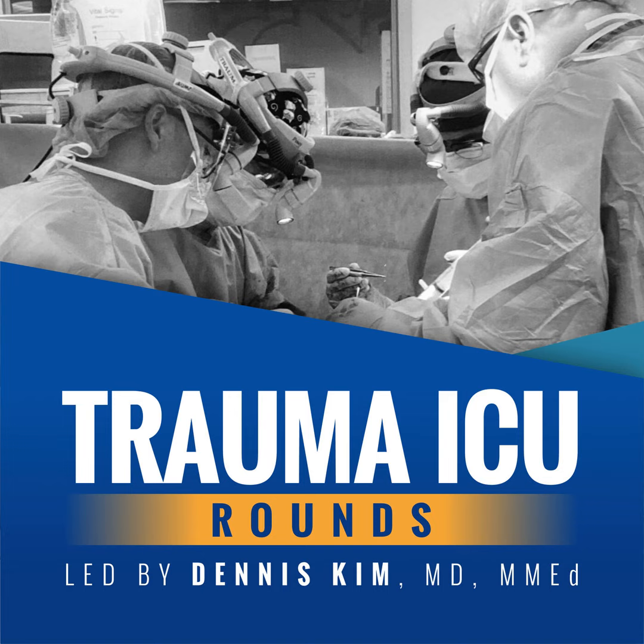So in summary, we've discussed the modes of mechanical ventilation, or at least some of the more common modes of ventilation and how we define them. And again, a mode is defined by the 3 T's. The type of breath, mandatory, spontaneous, or assisted, the targeted control, volume or pressure, and the timing of breath delivery, continuous, intermittent, or spontaneous based on the patient's own respiratory rate and effort.